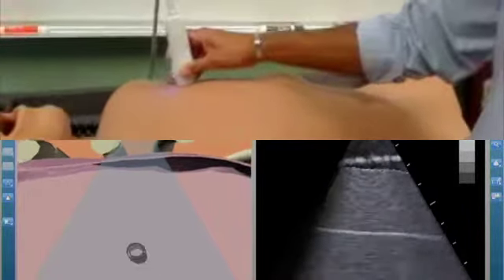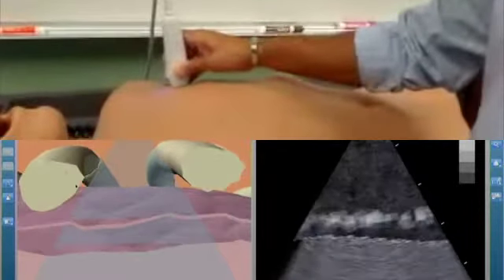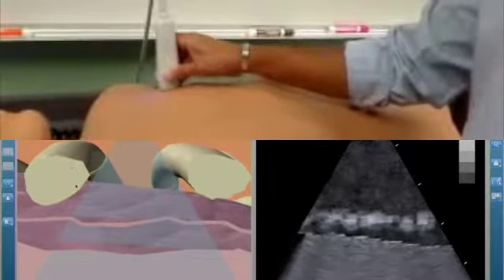So you can see here in this picture the concept of lung sliding. You see this slow movement of the lung pleura shown at the top hyperechoic line. I'll decrease the depth here to further accentuate this. And we're just looking for verification of this movement of the pleural line in between the ribs. So just to show the relationship, there's a rib, and there's another rib. Our ultrasound plane is cut in between those two rib spaces, and we're looking for that sliding phenomenon or the motion appearance across the lung pleura.